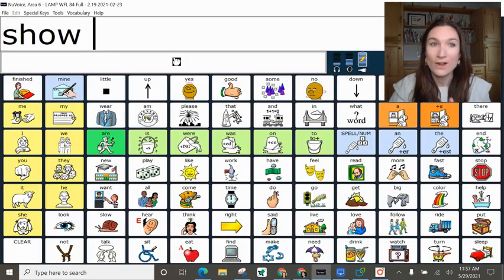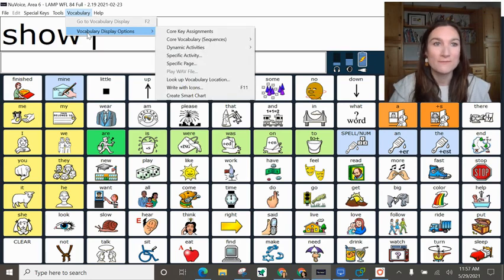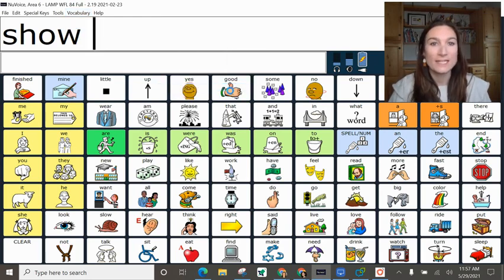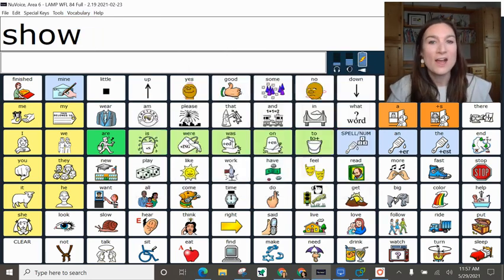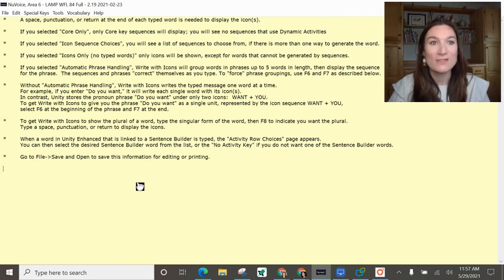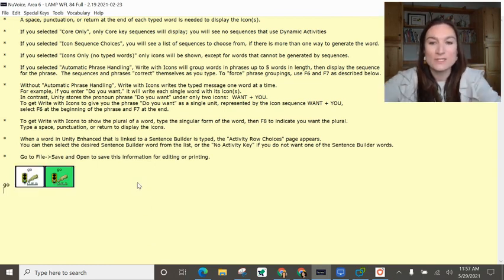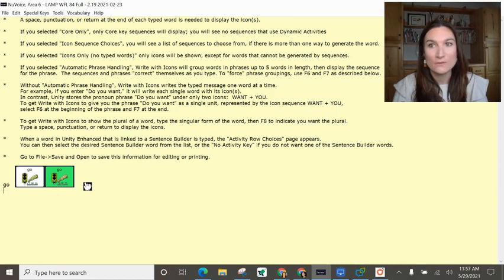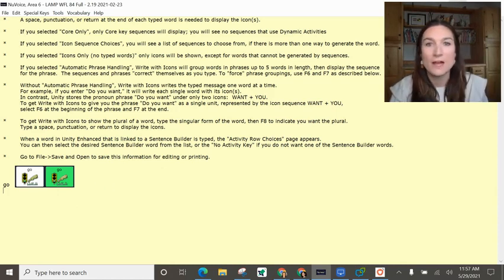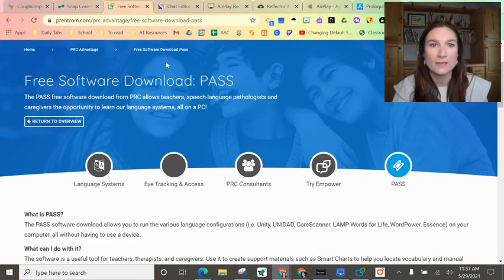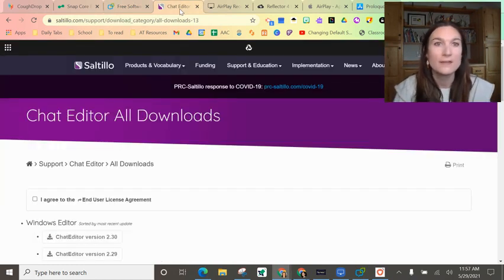However, I prefer Pass because of the feature to write with icons. Again, this is static display not dynamic display, but I love this because you can type in any word and then I screenshot those icon sequences. I use that a ton for making materials and for my therapy.